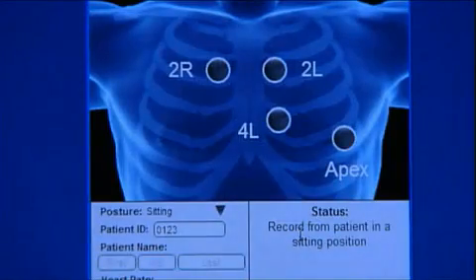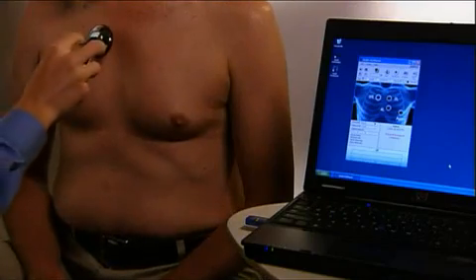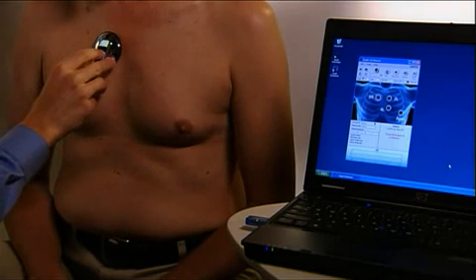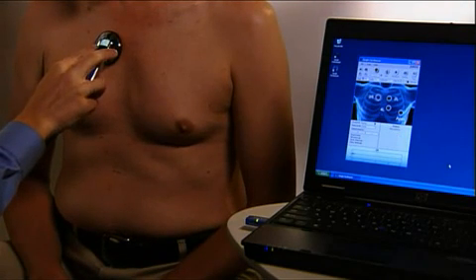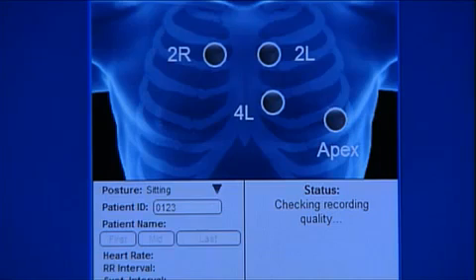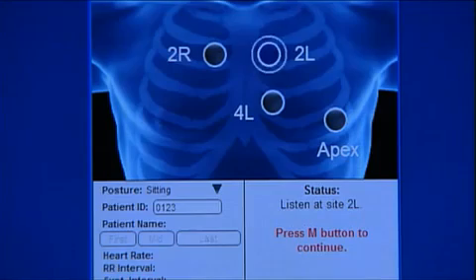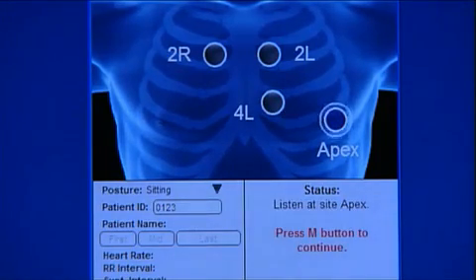The first recording is at the patient's 2R, or aortic, site. To start the recording, press the M button on the Littmann Model 3200 stethoscope. 20 seconds are needed for each recording. The second recording site is 2L, or pulmonic, site. The third recording site is 4L, the left lateral sternal border, or tricuspid, site. And the fourth recording site is at the apex, or mitral, site.